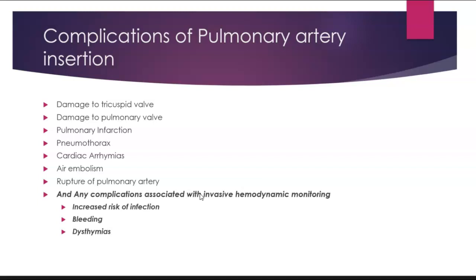It is a catheter that's hooked up to fluid, or should be hooked up to fluids, but since it's open to the environment as well, you can accidentally give your patient an air embolism. And then because this catheter is sitting in the pulmonary artery, and the pulmonary artery is getting pressure from the balloon occasionally, you can accidentally rupture your pulmonary artery as well. That would obviously have some pretty severe consequences because all the blood in your body is going to pass through the pulmonary arteries at some point, and the patient can bleed out really quickly. So there are complications, obviously, with the insertion and having this in place.